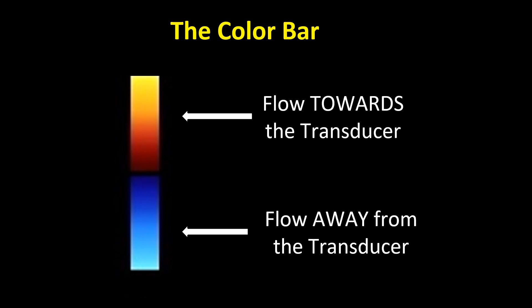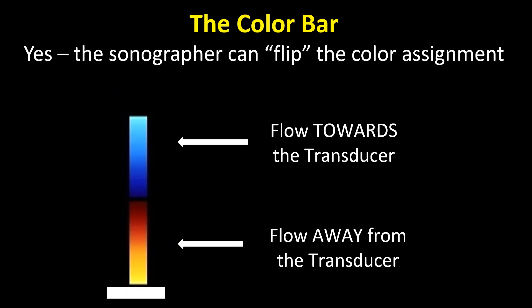Let's direct our attention to the color bar — this is very important. You always have to be aware of that. While there's some nuance among manufacturers, basically most use red and blue. Flow towards the transducer is always on the top, in this case red. Flow away from the transducer is always on the bottom, in this case blue. The sonographer can and often will flip the color assignment — in fact, many times this is done automatically by the instrument upon beam steering. In this case, note flow towards the transducer is blue and flow away is red.